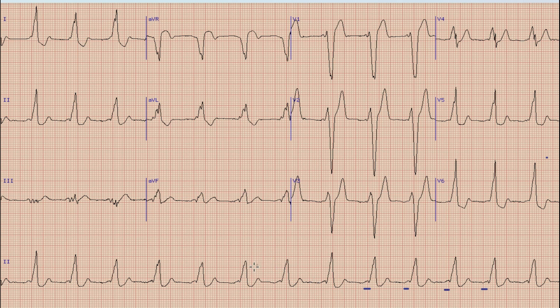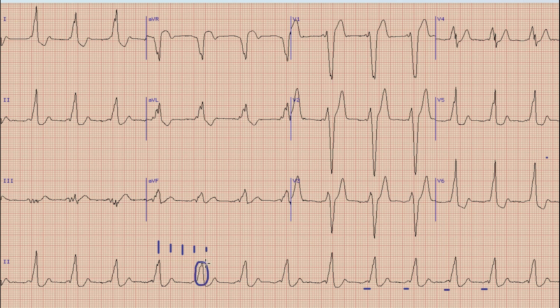Next is heart rate. For heart rate, we select a QRS complex which lies on a broad vertical line, and between this QRS complex and the next QRS complex we calculate the large boxes as 300, 150, 100, and 75. The second QRS complex lies between 100 and 75, giving us almost around 80 beats per minute. So this is a sinus rhythm with a heart rate of 80 beats per minute.